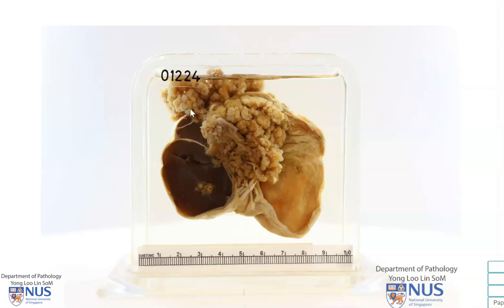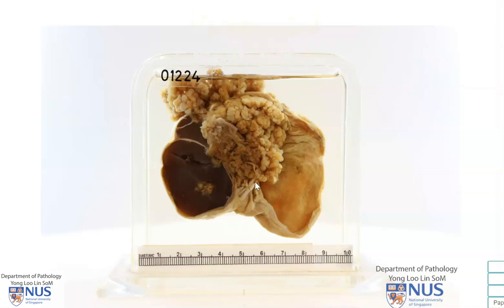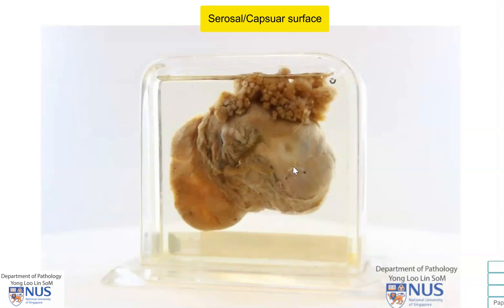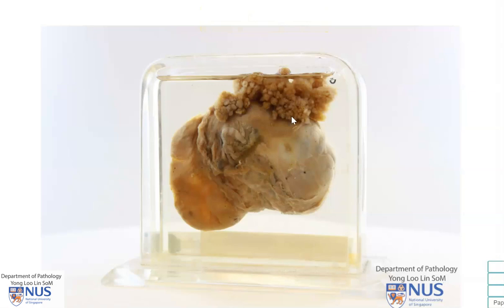This is a pathology specimen showing the cut surface of a multilocular ovarian cystic tumour. We know that there are multiple locules because each locule is one compartment within the cystic tumour, and we can see here that there are about four locules on the cut surface. Looking at the serosal or capsular surface of the ovary, this is also abnormal because there is evidence of a papillary tumour here.